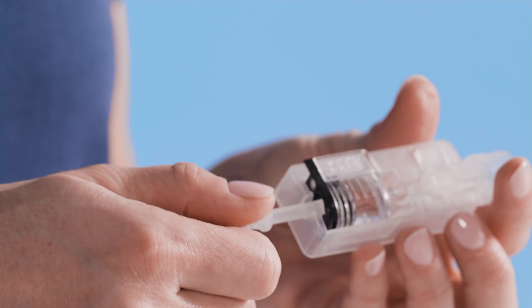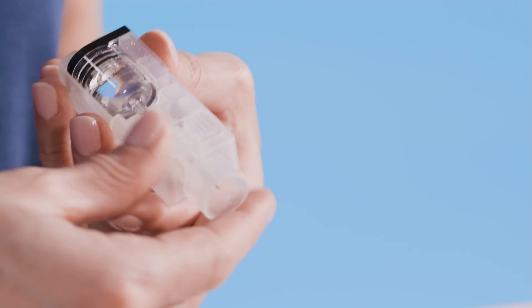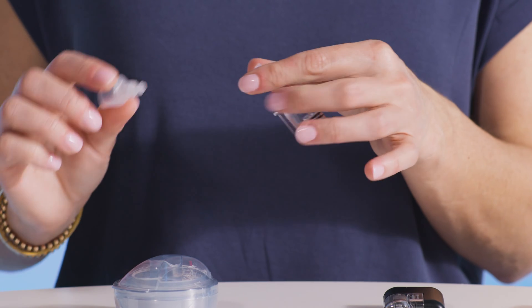Now it's time to remove the cartridge from the set. Start by unscrewing the fill rod counterclockwise. Then, gently release the cartridge from the set. Now, unscrew the vial adapter counterclockwise to remove it from the T-lock connector. Be sure you're following all proper disposal methods for needles, cartridges, set components, and infusion sets.